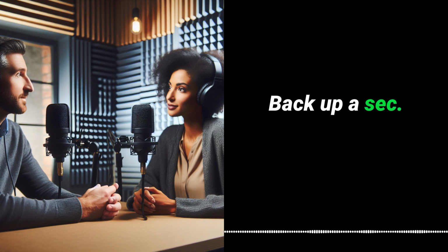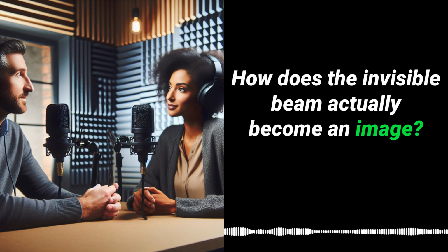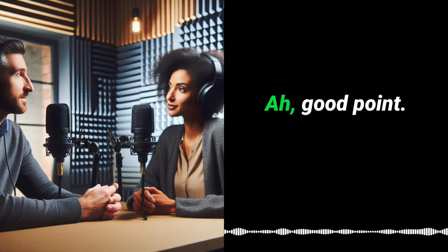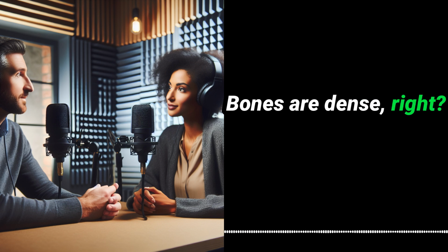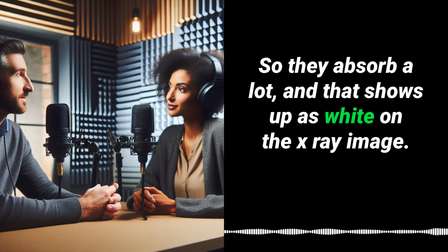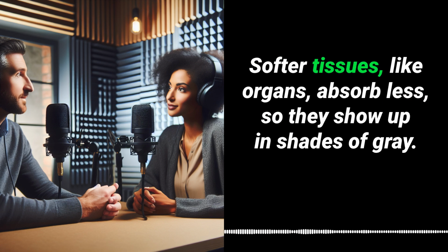Hold on, back up a sec. How does the invisible beam actually become an image? It's not like we can see X-rays. Ah, good point. You see, different parts of our body absorb different amounts of X-ray energy. Bones are dense, right? So they absorb a lot, and that shows up as white on the X-ray image. Softer tissues, like organs, absorb less, so they show up in shades of gray.